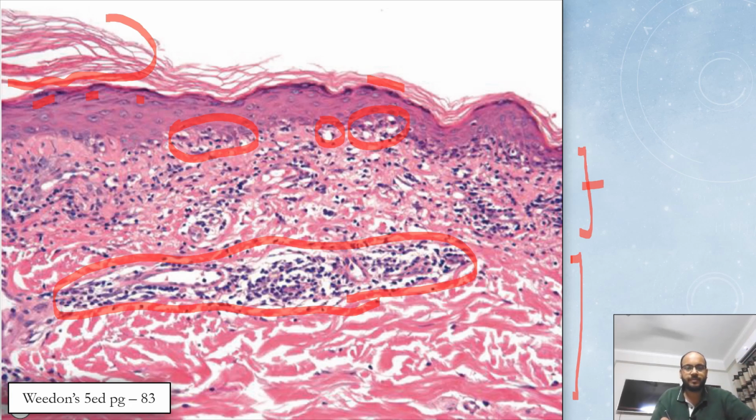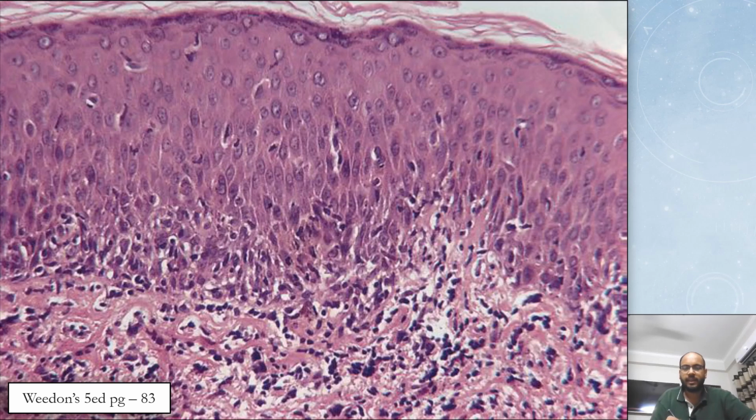Let's move forward. In this, you can easily see that vacuolization is again a predominant feature. Look at all these empty spaces. As compared to DLE, you see more of epidermal features with a sparse infiltrate, more of vacuolization, while in DLE, you see less vacuolization.